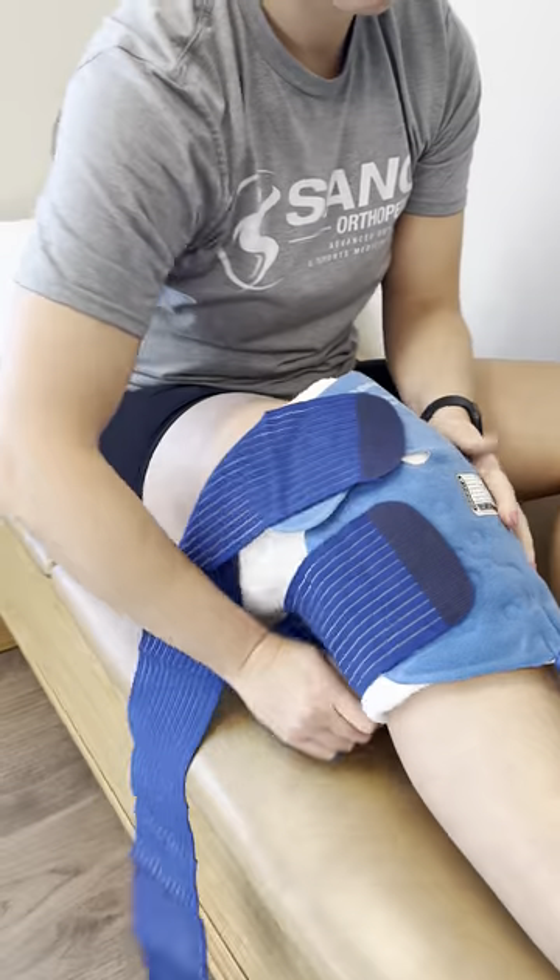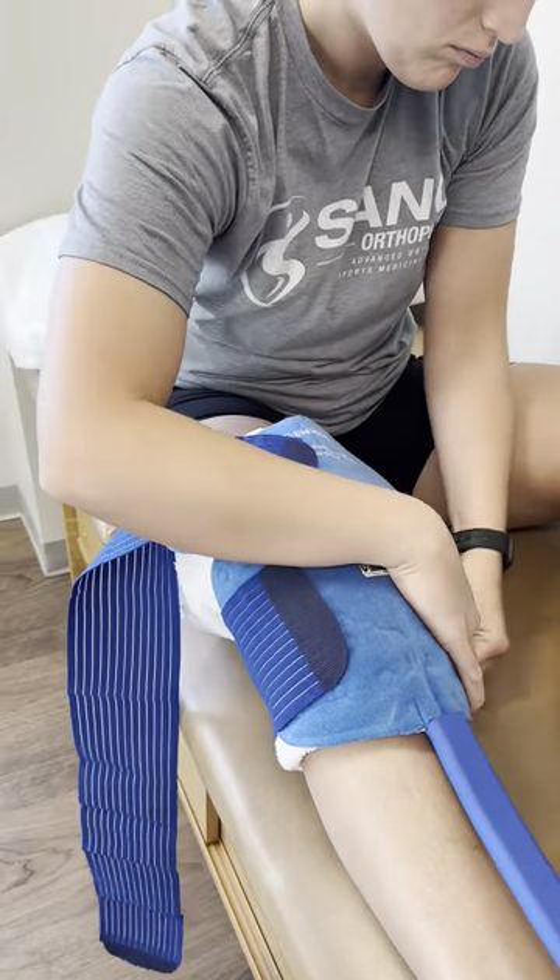To secure on the knee, you typically just wrap the two straps around and tighten to your liking.